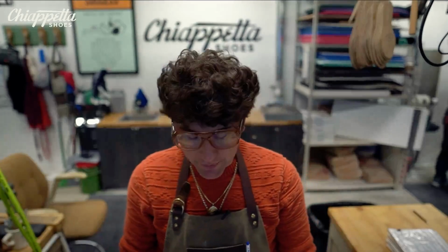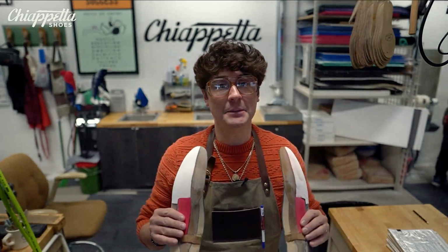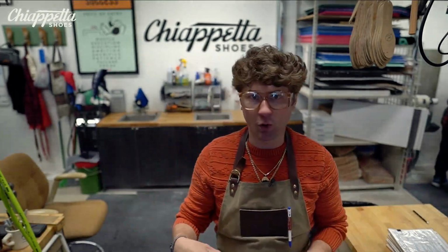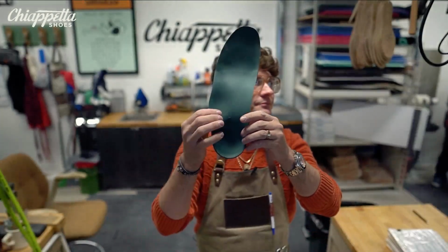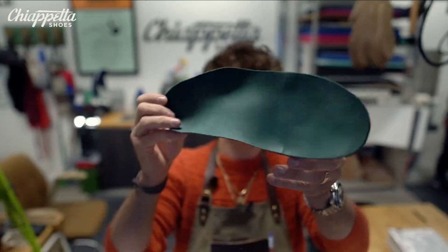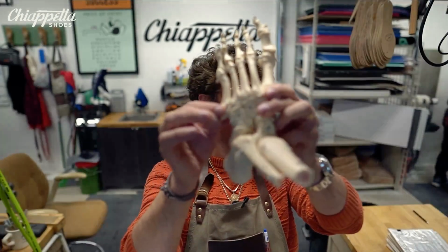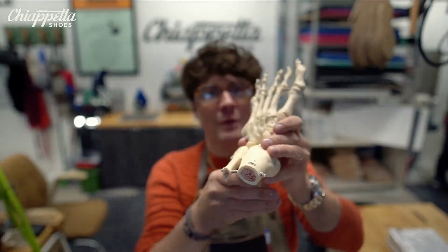Now, this customer has been a tricky one. We've had custom orthotics for about 2 months now. We have not been able to get comfortable. He went pretty much his whole life just wearing normal flat shoes and was having a lot of issues, because if you look at the contour of this custom orthotic, there is a huge, large fifth metatarsal expansion, okay? So when we deal with this kind of stuff, we want to balance the weight off.